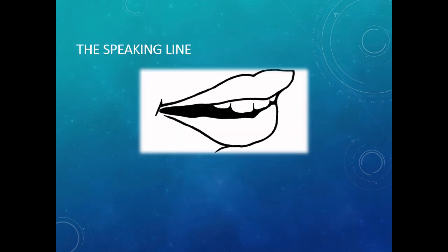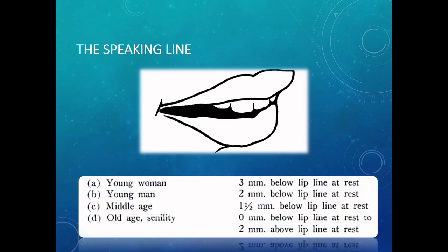Next is the speaking line, which is the incisal length or vertical composition of the anterior teeth. So when the patient is speaking seriously, one should evaluate the tip of the lateral incisor. And this is the guide to the vertical composition using the incisal edge of the central incisor in its relationship to the lip line at rest. Here you can see that for a young man and woman, it is 2 to 3 mm below the lip line, whereas in middle age and old age, it decreases. So, according to this guide, the tip of the incisor should vary in different degrees according to the sex and age requirements.